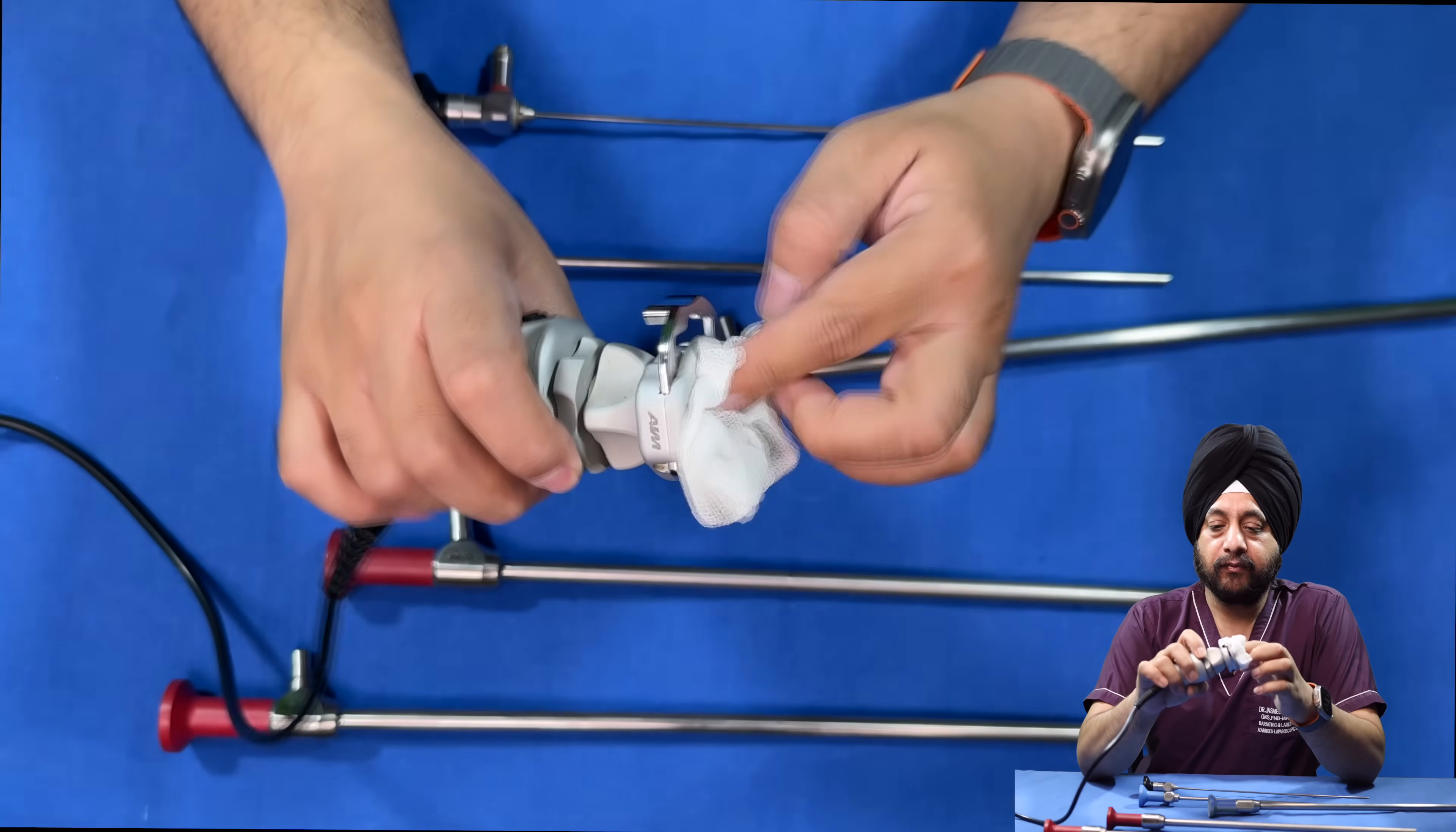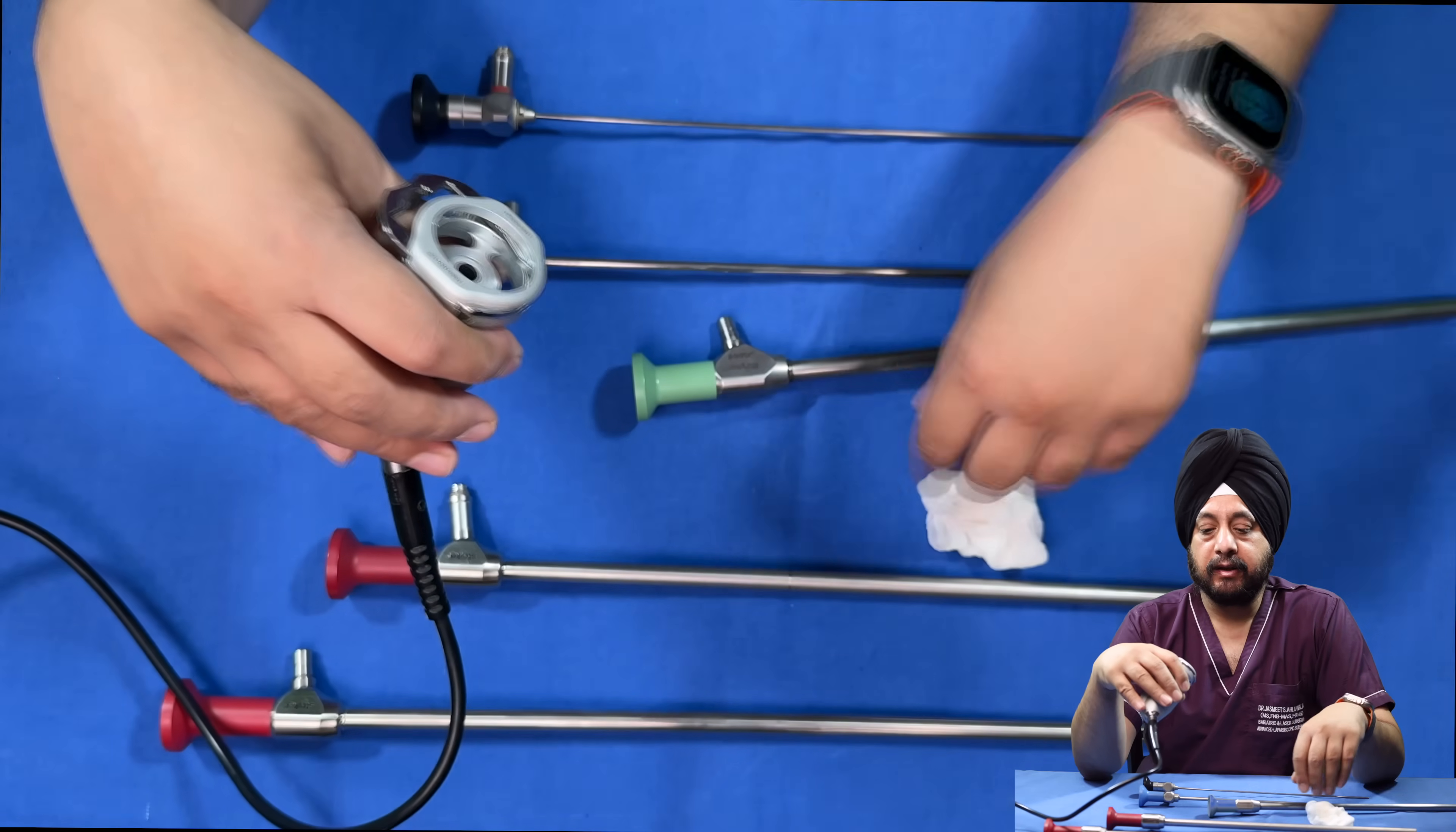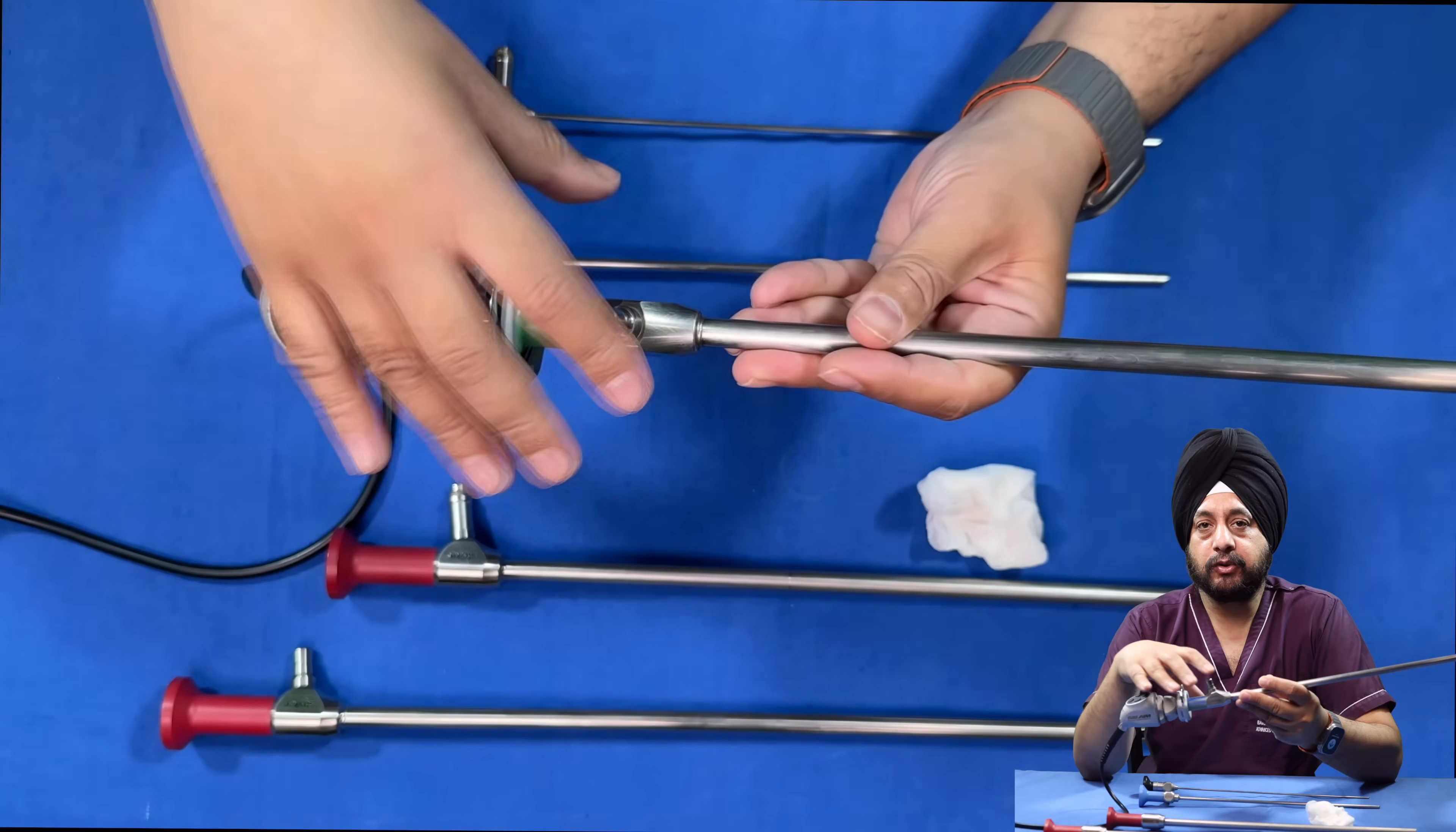Similarly, always clean the head of the camera with sterile gauze. The gauze should be very, very dry. Again, reflect light off the tip of the glass covering the lens and make sure it is absolutely clean before you make this junction. Once it's done, it doesn't get dirty during the procedure, so make sure you clean it very well before the surgery begins.